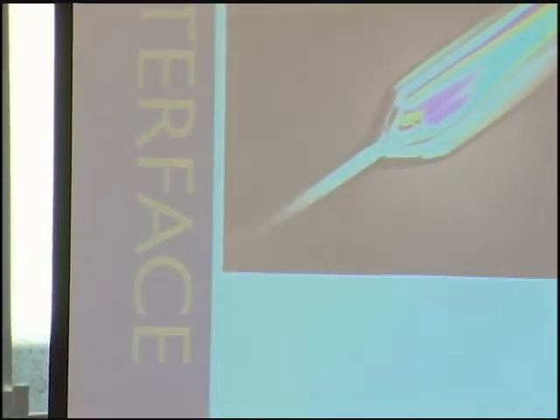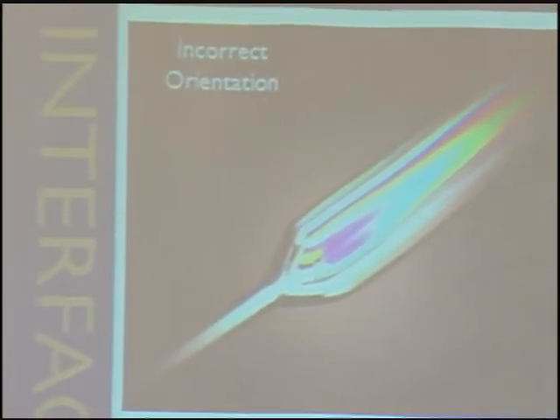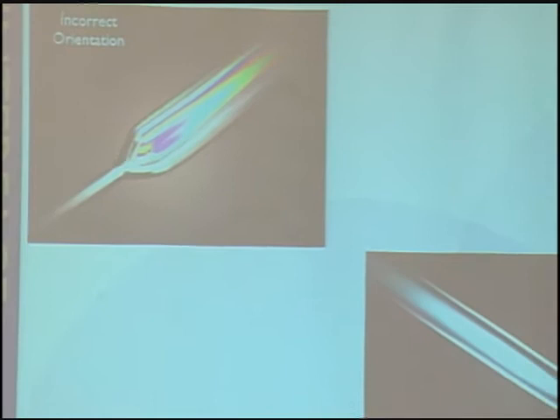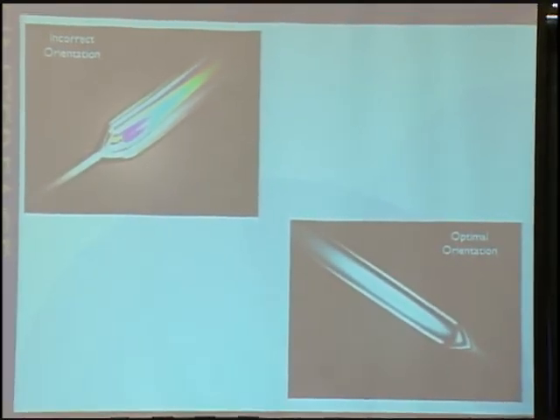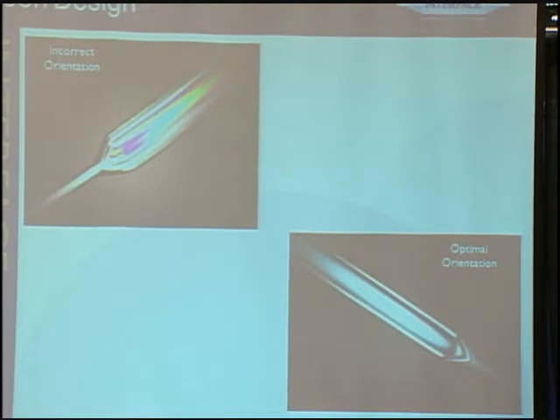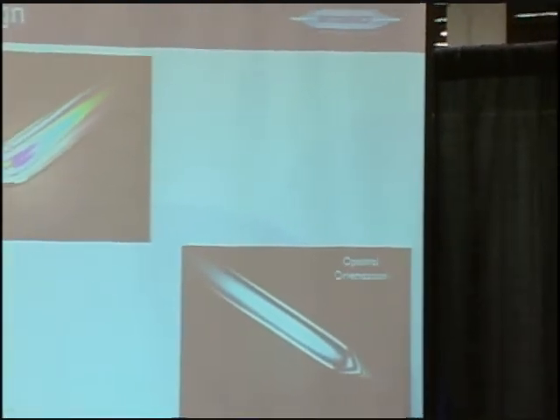Okay, and this here is showing through polarized lighting the orientation going through. You've got incorrect orientation on the left and then the optimal orientation on the right. And this is an exaggeration, but you could see why it's so important that every balloon diameter has its own unique balloon tubing size. Because if it doesn't, your whole family of balloons are going to have different performance characteristics. Your 2 millimeter might have a compliance of less than 5 between nominal and RBP, and then your 10 millimeter might be 12, 13% because your expansion ratios and longitudinal stretch are not constant.